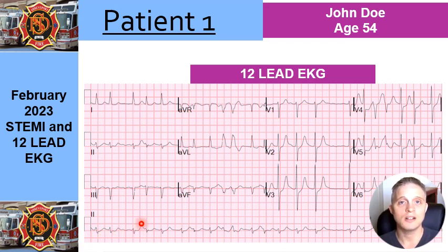and then the next step is you need to decide the rate. And so we have rhythm and rate. Is it fast or slow? Some resources will say 140, some resources say 150 to determination of AFib RVR.